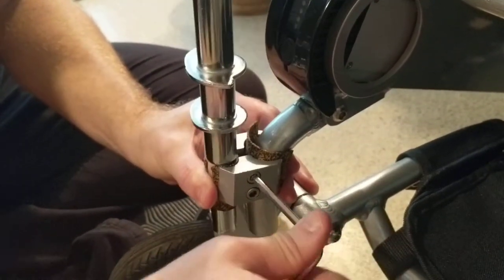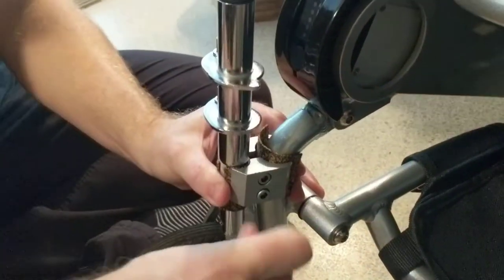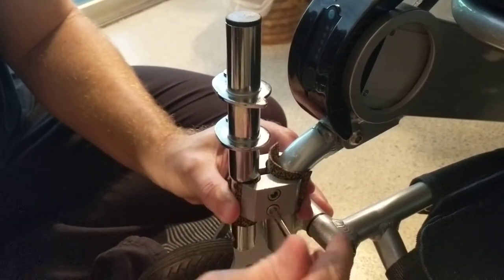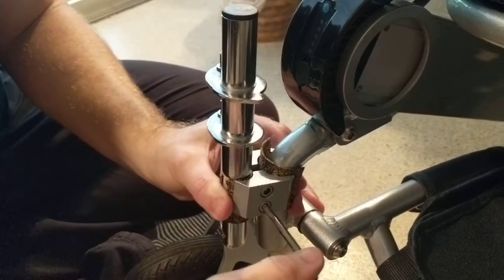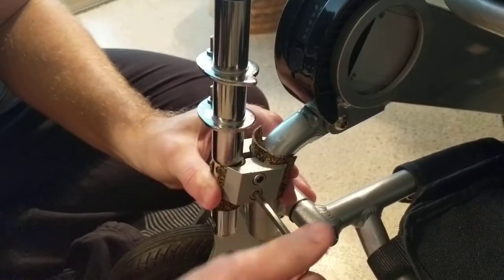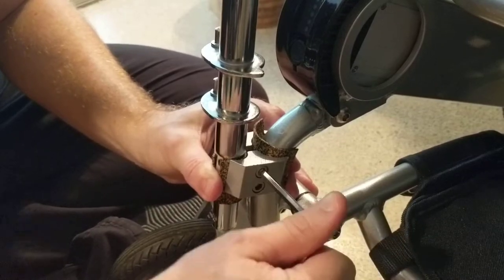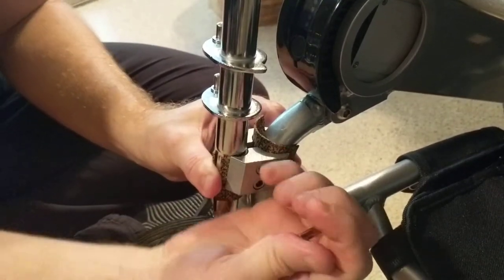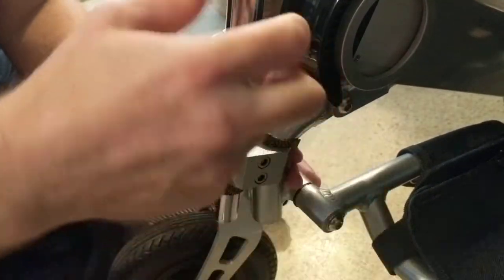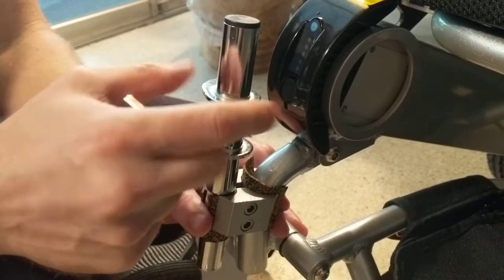We're going to start to tighten everything up. A couple of things I'd like to caution you on: these parts really need to be very securely tightened and fastened. If you feel you might not have enough strength in your hands to do this, I definitely advise you to have somebody else finish the tightening process.